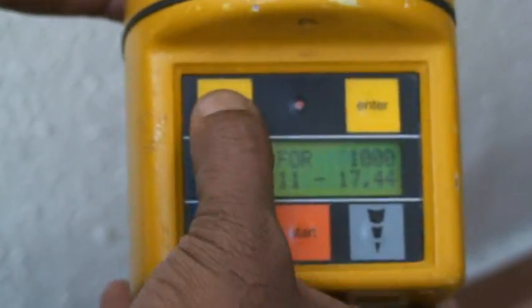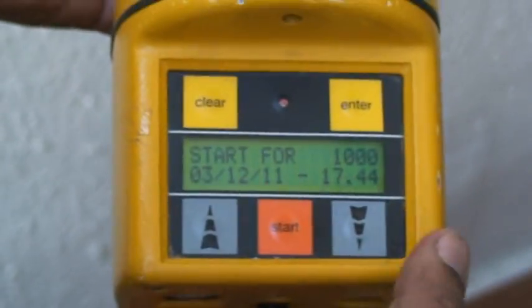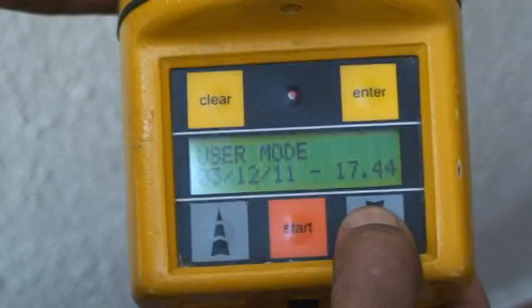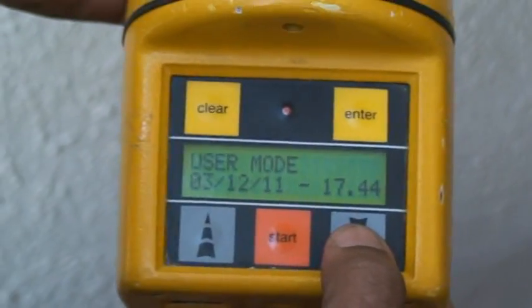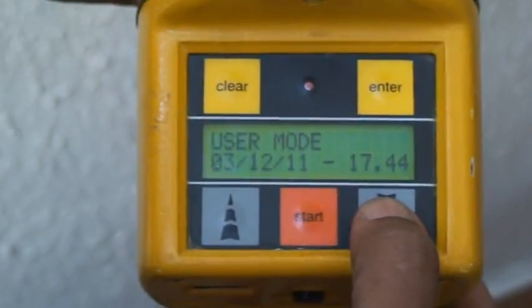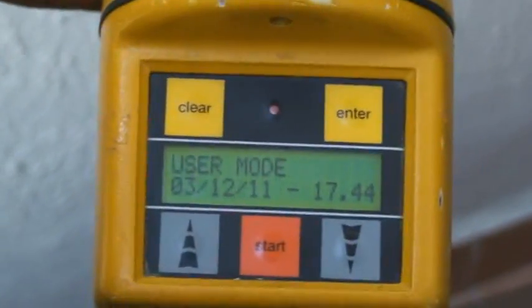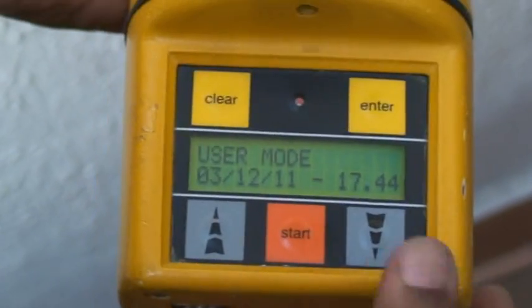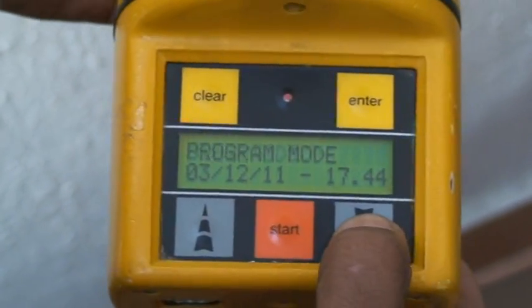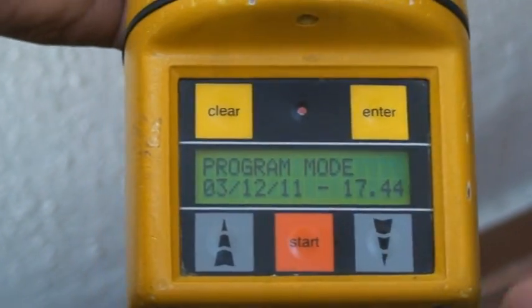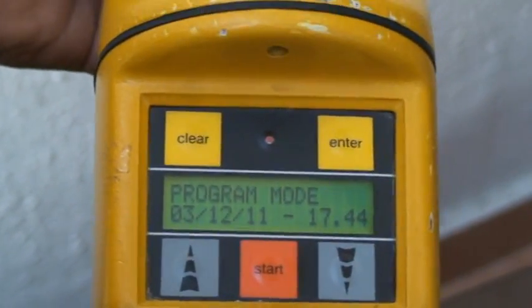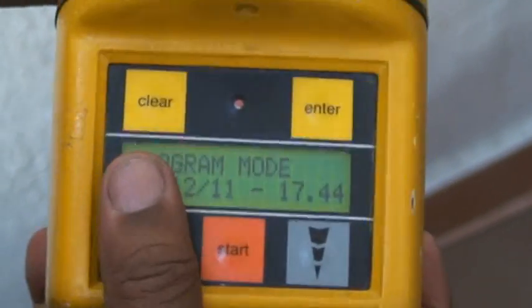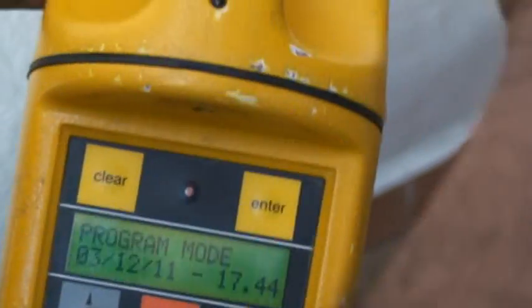To exit, press 'clear'. That was the first mode — standard mode. The second mode is user mode, where you can program your own timing as well as the volume. The third one is program mode, which is again for programming the volume setting — how much volume you want to sample.